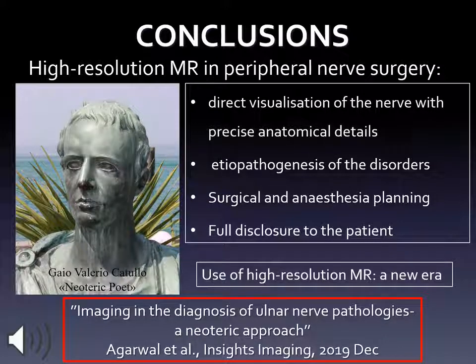The introduction of imaging techniques capable of demonstrating the intrinsic signal of nerve as well as of displaying structural linear properties of neural tissue is progressively transforming all of neuroimaging, even as it transforms our approach to diagnosis, treatment planning, and surgical access, bringing us to a new era.